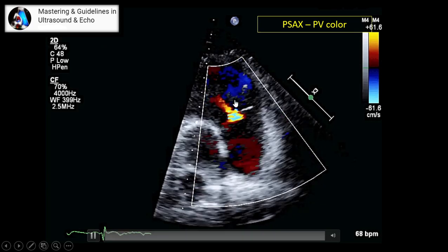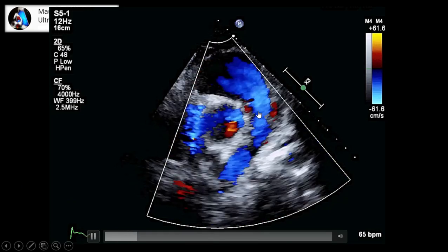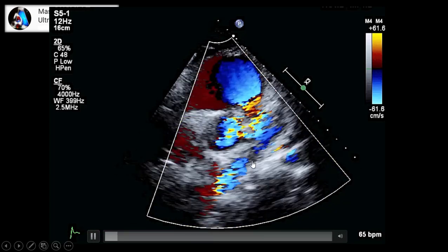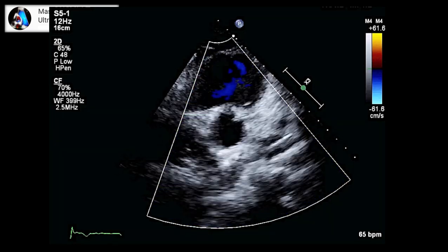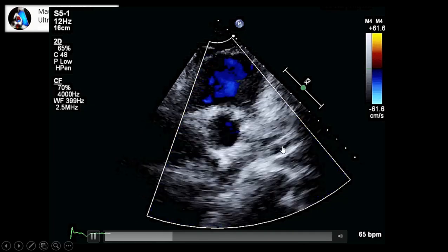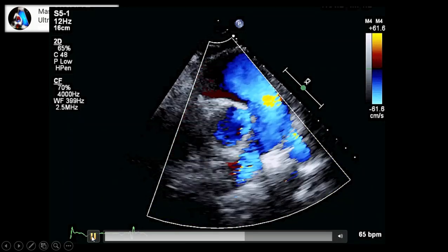If there is any abnormal blood flow, PI, we put continuous wave again at that spot. Sometimes, if you need to show more for any reason, for example suspicion of pulmonary embolism in the main branches, we can fan a little, angle a little more up, and twist more or less. We can show those branches deeper, the left pulmonary and right pulmonary, more distal, and find those spots.